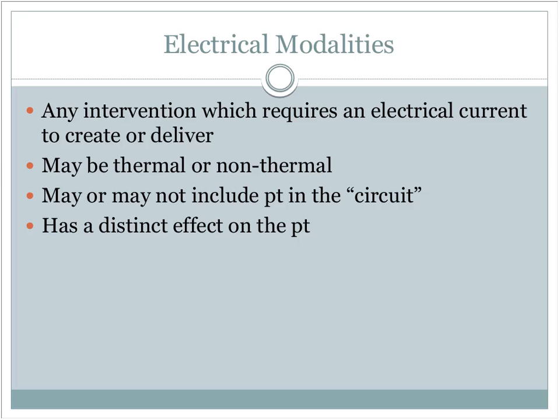Electricity can always have an effect on people, sometimes positive, sometimes negative. Of course, we're looking for a positive effect. I say that because if we're not having a distinct and hopefully positive effect on the patient, we're either doing it wrong or it's not a valid modality for treatment of that individual.